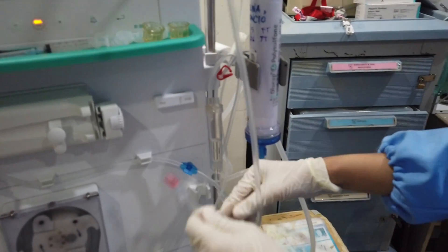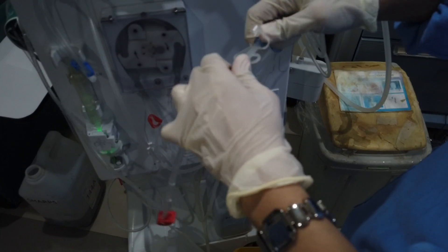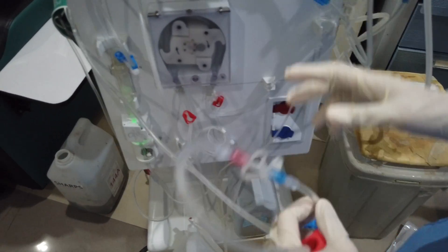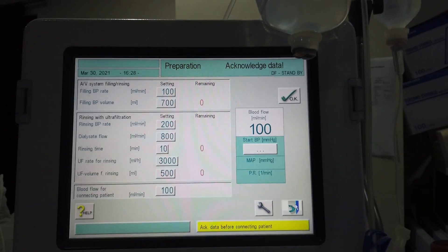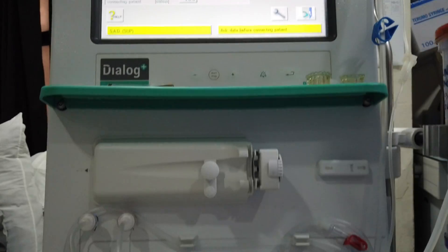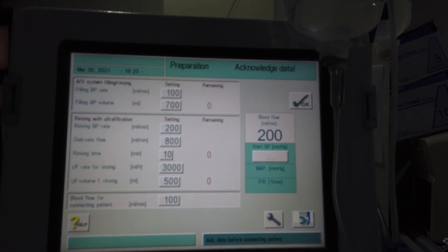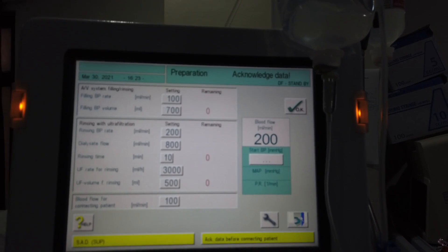Start the blood pump and recirculate the remaining 300 ml. Once the 700 ml is consumed, stop the blood pump and attach back the arterial and venous patient's end line. Then start the blood pump and recirculate for 20 minutes. You can increase it to 200 ml per minute for the last 5 minutes. Once done, you're ready to hook it to patient.